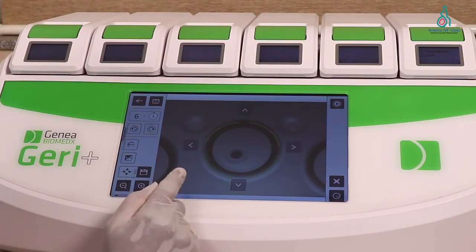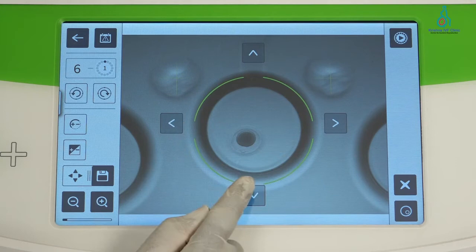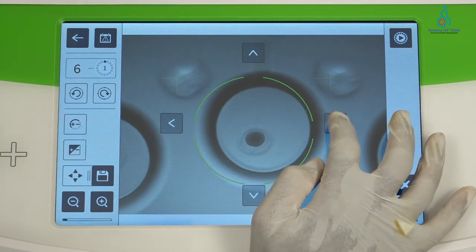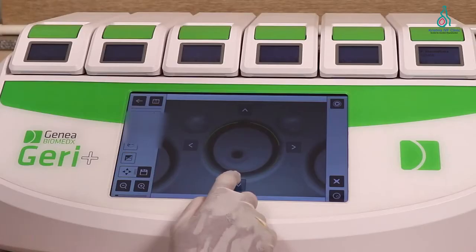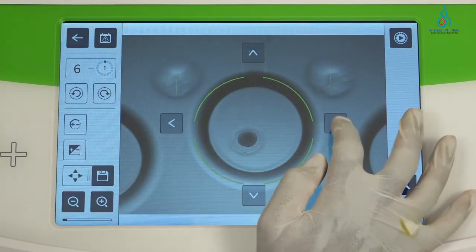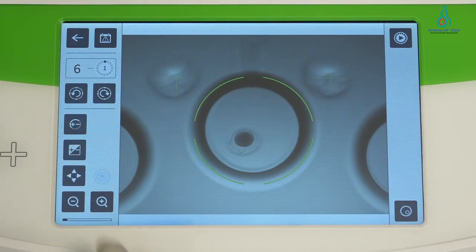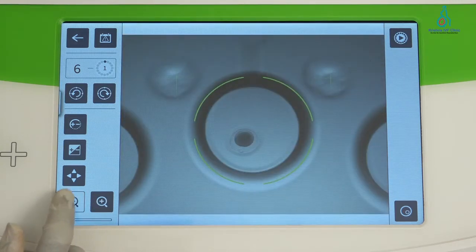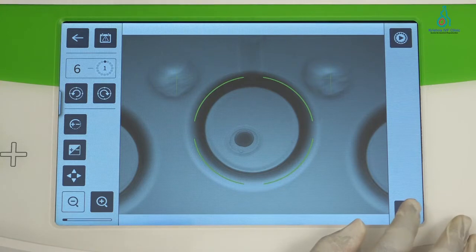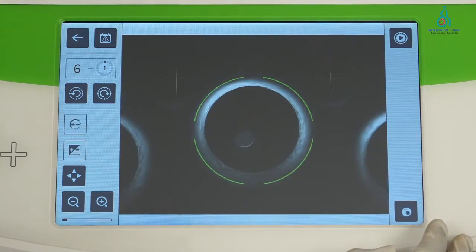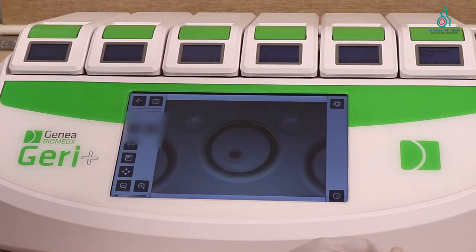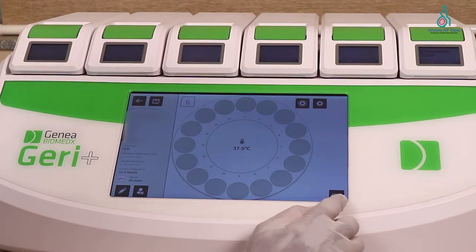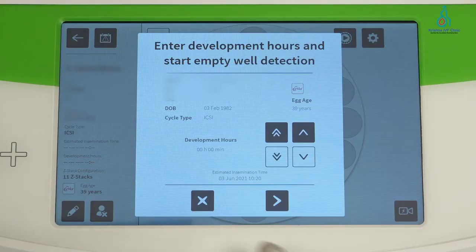Here we are adjusting the wells along with the camera. If a well is outside the range, we can adjust it using the directional keys — right, left, up, and down. Then save it. This control is for the closer view and the long view. This is for the dark field selection. Once done, we proceed to start the empty well detection.